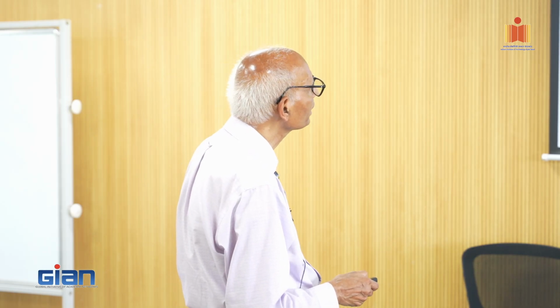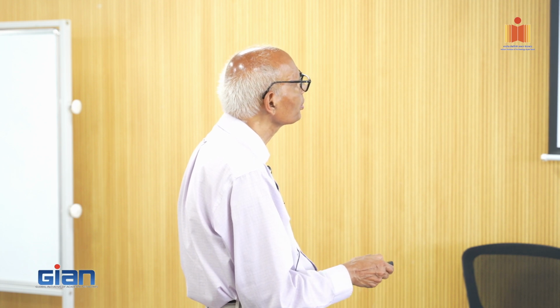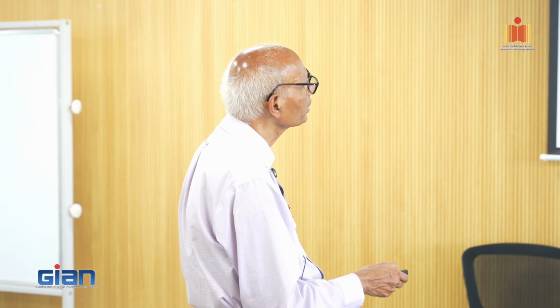There's an 80 degree field. Yeah, this is the 80 degree field, with a couch kick of 315 degrees. And then there's a PA beam at 180 degrees with no couch kick. This is a head and neck target.